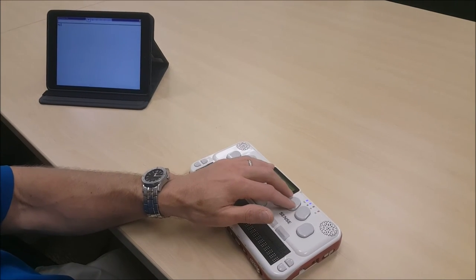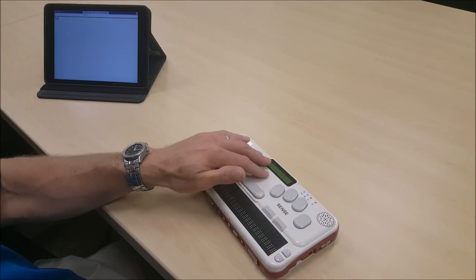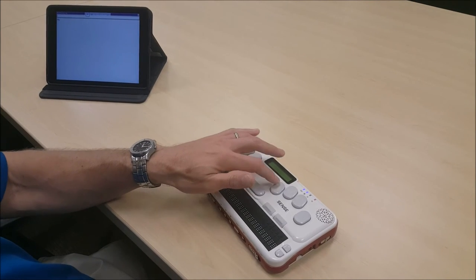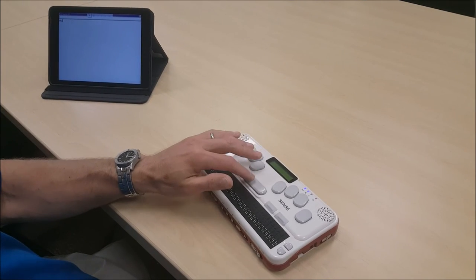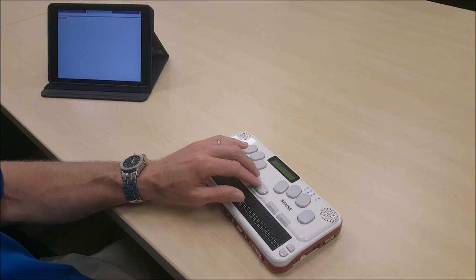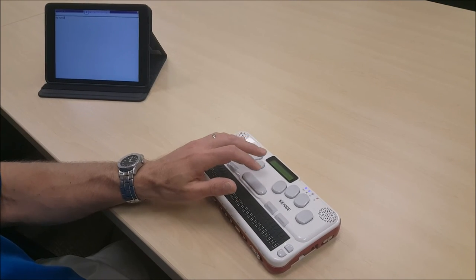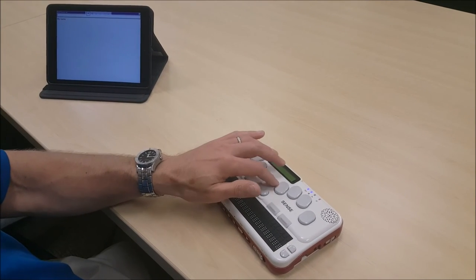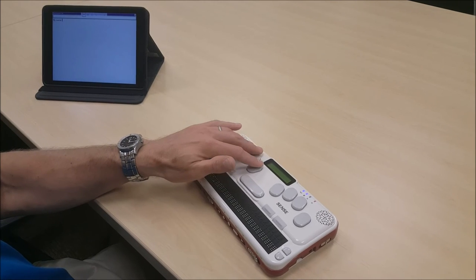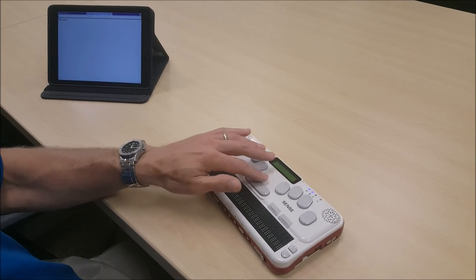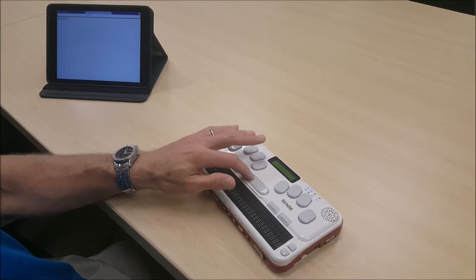Now we're going to write a name starting with dot 5. Dots 1, 3, 4, 5. Two spaces to put a space in the document.